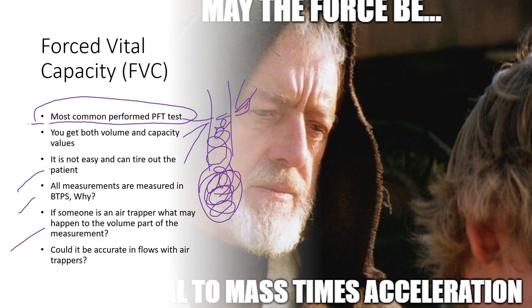Could it be accurate in flows with air trappers? Yes, it's still going to get accurate flow rates for these patients no matter what. So someone has COPD, emphysema, uncontrolled asthma, are we still going to get accurate flow rates from this test? Absolutely. It's just their volumes and capacities might read low if they're trapping gas.